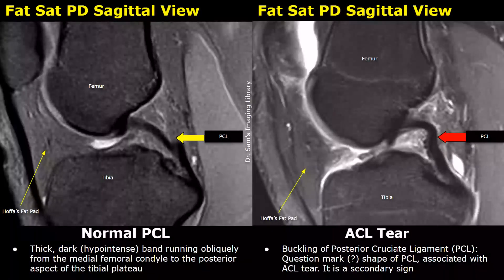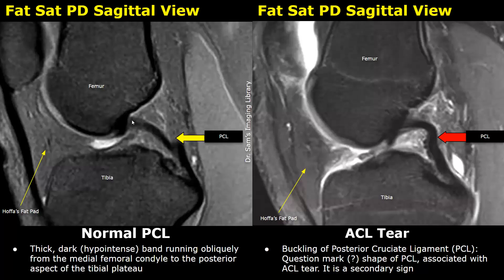Now we will look at some secondary and indirect signs of ACL tears. The appearance of the posterior cruciate ligament is also helpful in diagnosing ACL tears. In the image on the left, we can see a normal PCL — the posterior cruciate ligament — in sagittal plane. It appears as a hypointense band running obliquely from the medial femoral condyle to the posterior aspect of the tibial plateau.